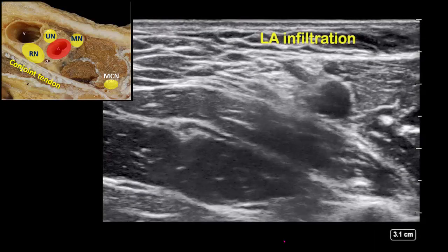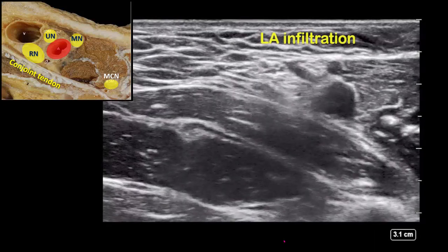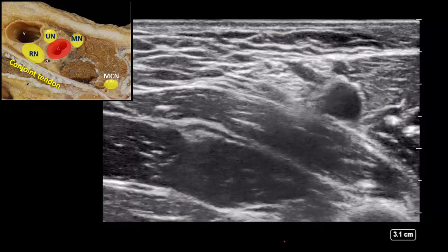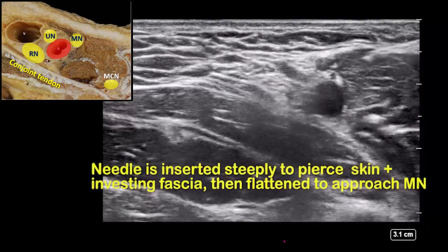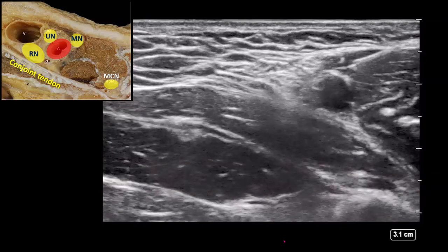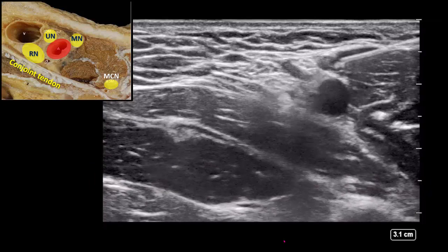I currently favor an approach that targets the median, radial, and ulnar nerve in the same pass. Infiltrate the skin insertion site with local anesthetic. Angle the block needle steeply to puncture the skin and investing fascia, then flatten to advance through the coracobrachialis muscle.